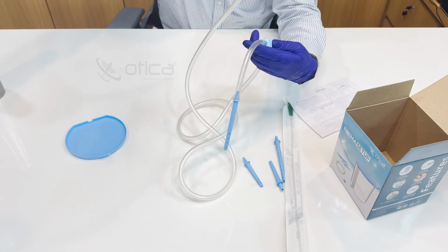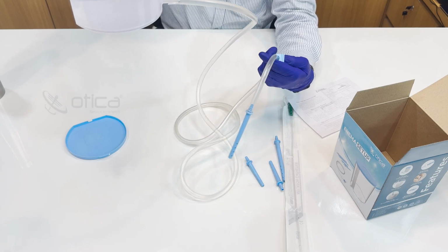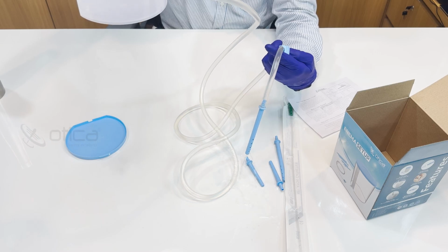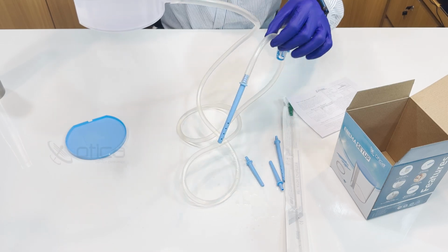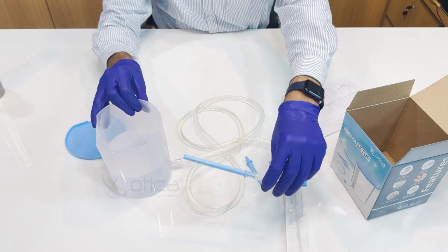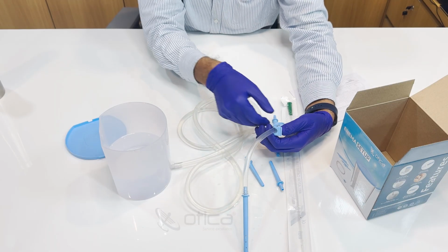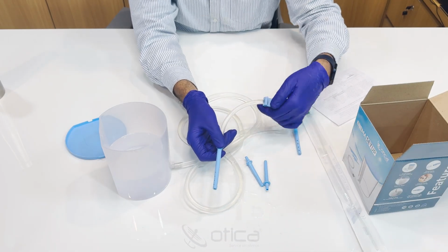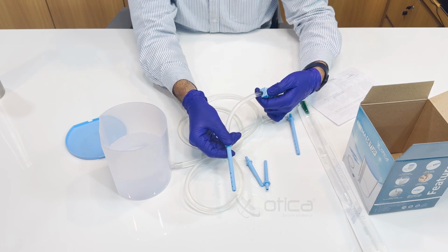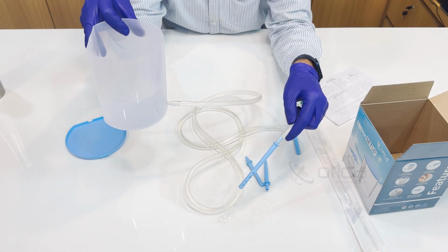When you start opening the controller, only then will the flow start coming out of the tube. You can see. But when you lock it, you can see I have locked it properly, and there is no leakage from this end. Whenever you open this controller, only then will it start giving you the flow. You can see I have opened it, and when the bowl is at height, you can see the water is flowing through.